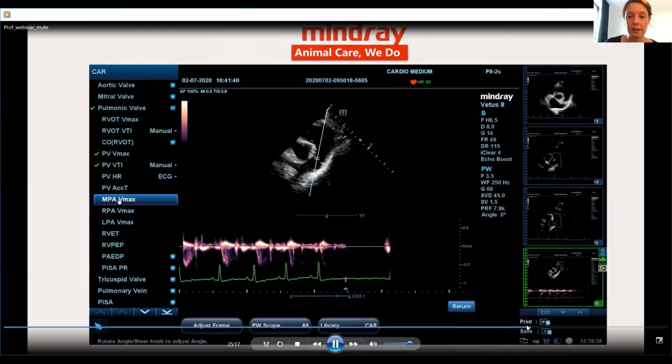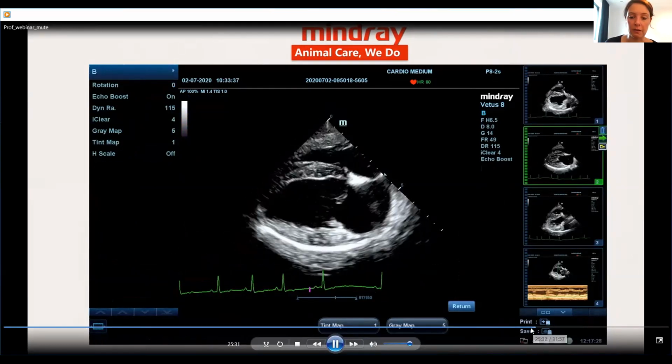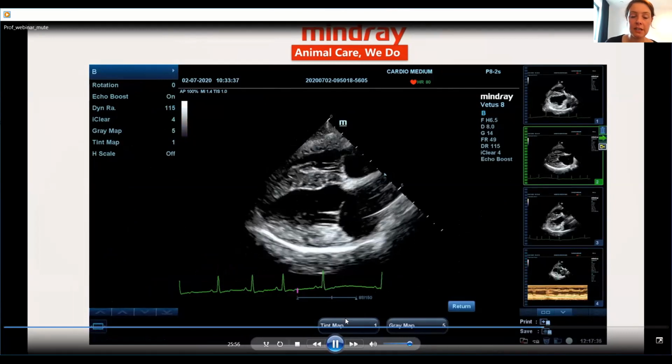Okay. Let's move on. So this is the pulmonary artery velocity measurement. Here you see the pulmonic valve. This is the bifurcation, the right main pulmonary artery and the left main pulmonary artery. And this is our pulsed wave measurement. So you go to the pulmonic valve, and there you see the pulmonic velocity, Vmax, and you can measure the velocity. Important for this is that you don't measure all the way until the end of the little feathery edges, but that you measure where your signal is delineated best. If you have these feathery edges, these profiles are not very good, but sometimes you still have some edges here. You don't measure all the way down, you measure where you have a good delineated signal.